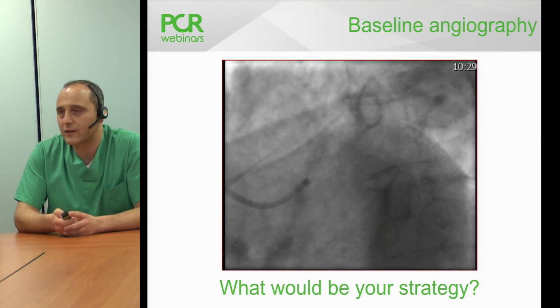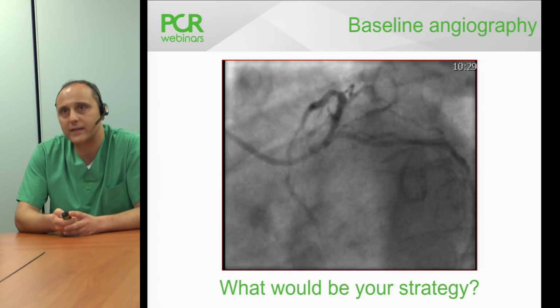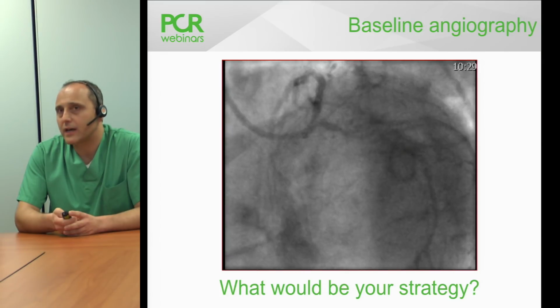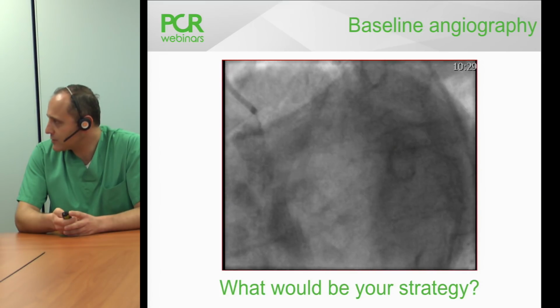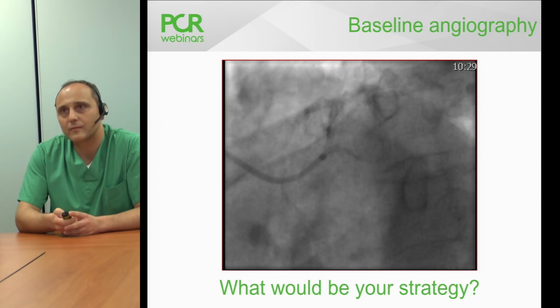The majority, if not all, of the colleagues agree that we should do additional evaluation of this left main. Now, let me ask you the next step. First, do you agree with them? Absolutely. We need to do so. Taking a decision just based on angiogram, I think it's not reliable in this case.